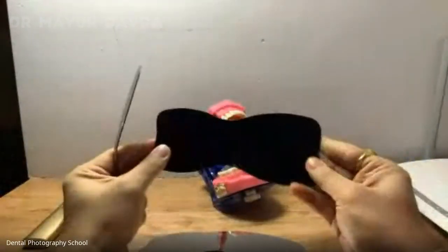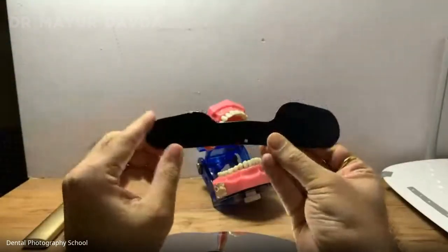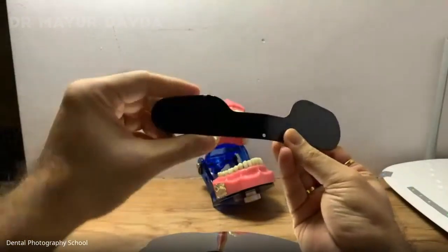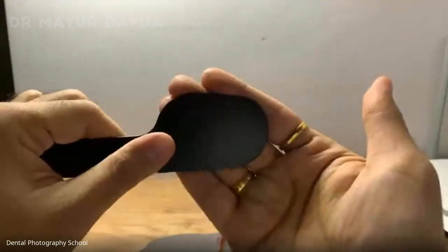Right? So this is a full arch occlusal contrastor. This is a pediatric size, and there's an adult size. And this is a buccal contrastor, also called the lingual contrastor, or the lower anterior aesthetic contrastor. So this small part is for lower anterior aesthetics, and this big part is for buccal shots.